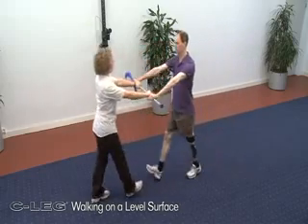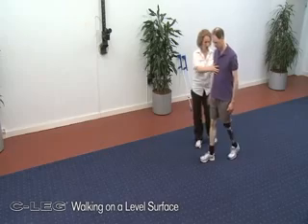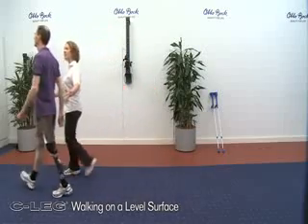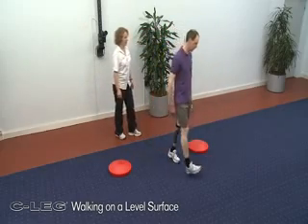In addition to learning the proper walking technique, the patient should complete the strengthening exercises described in the following section at regular intervals. Once the swing phase can be initiated reliably, this is practiced during unsupported walking.